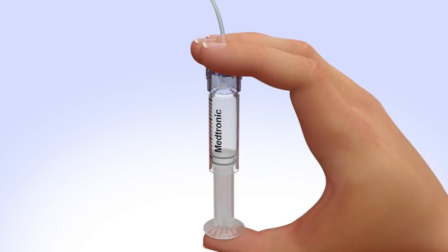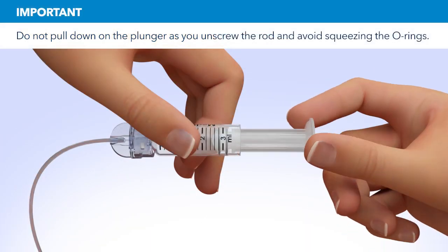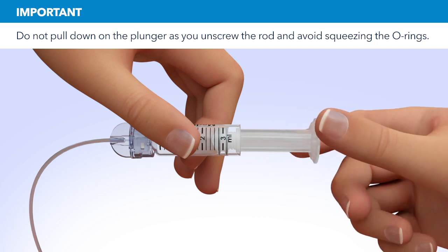Purge the air bubbles that have risen to the top by slowly pushing up on the plunger until all of the air bubbles have been pushed out of the reservoir and you see a small amount of insulin in the tubing. If you're not able to push insulin into the tubing, disconnect the tubing connector and then reconnect it. Unscrew the plunger rod counterclockwise until it completely separates from the reservoir.